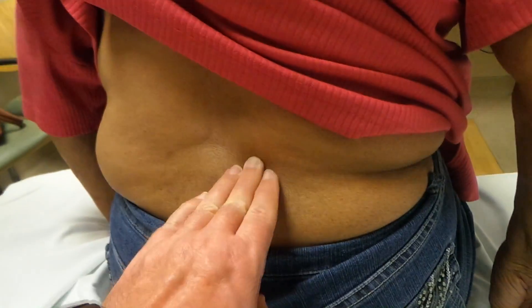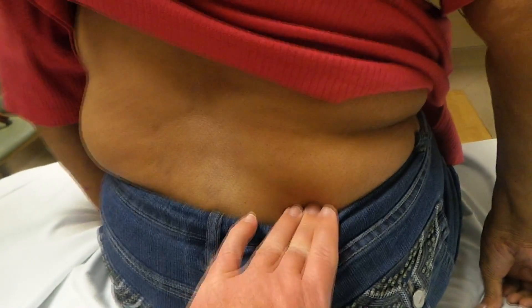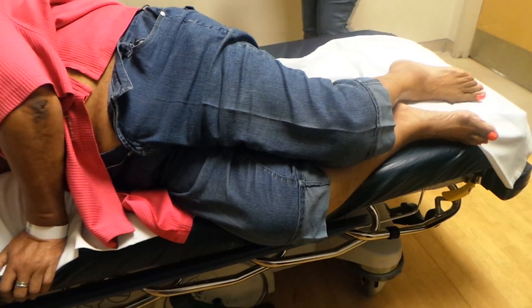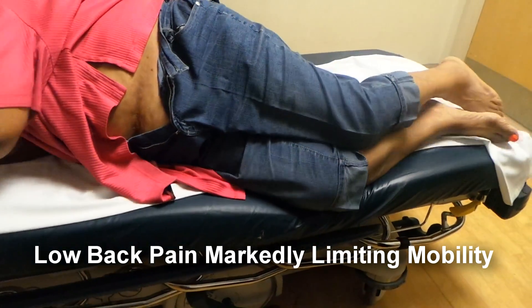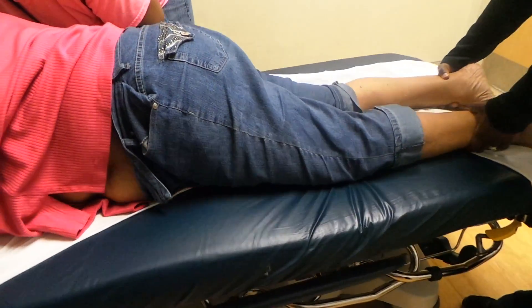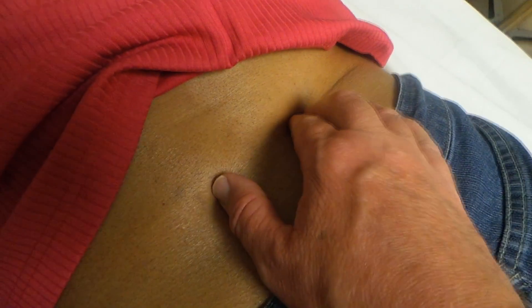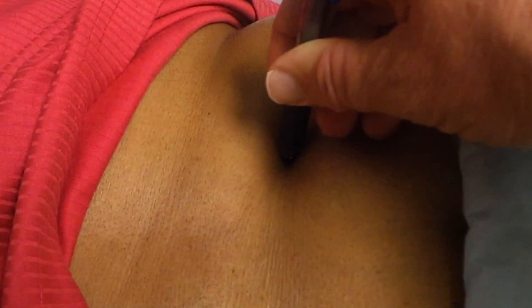Do you hurt here? Oh yeah. Hurt there? Hurt there? Hurt there? But it gets really bad down in here. Some pain up here, some pain up there, some pain up there — but right around where you're having pain. What I'm doing is I found this place and I just went down with my pen just to make an indent in the skin so I know where my target is.